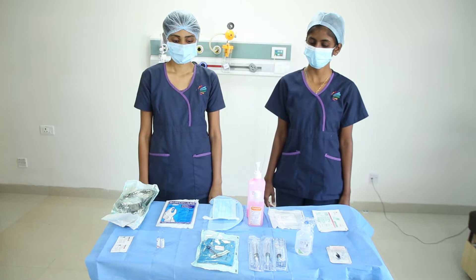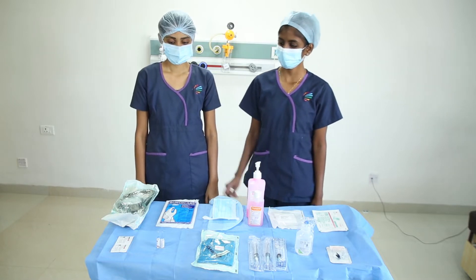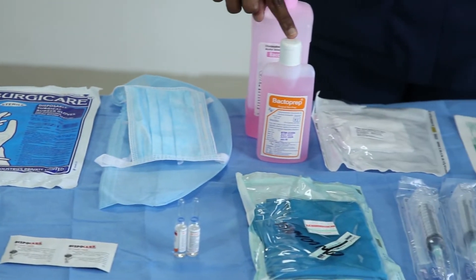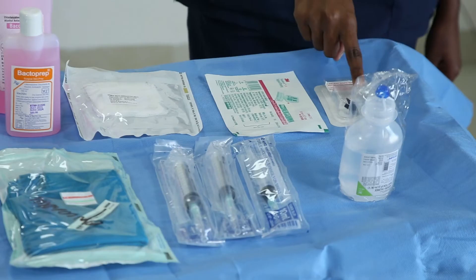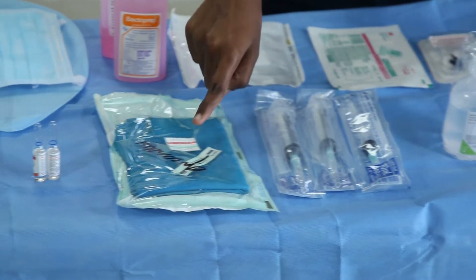In order to access a porta-cath, we will need the following things: central venous accessing dressing tray, sterile gloves, mask and cap, chlorhexidine, sterile gauze pieces, occlusive dressing like tegaderm and tape, chemo port needle, normal saline, 10 cc syringes, hole towel, and heploc.